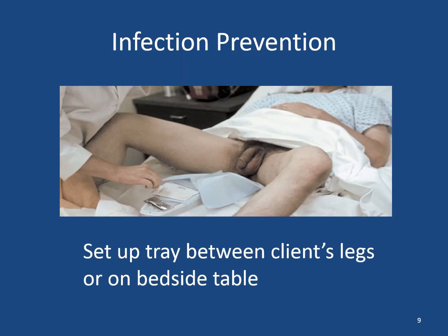Okay, stand on the client's side, right side if you're right-handed, left side if you're left-handed, because you're going to end up planting your non-dominant hand to stabilize the client when we're placing the catheter. Ideally, you want to set up the equipment while you have both hands available. So you're going to set up the entire kit and set up your field when you have both hands, because again, once you plant that one hand, you are down a hand and you cannot remove it from the client.